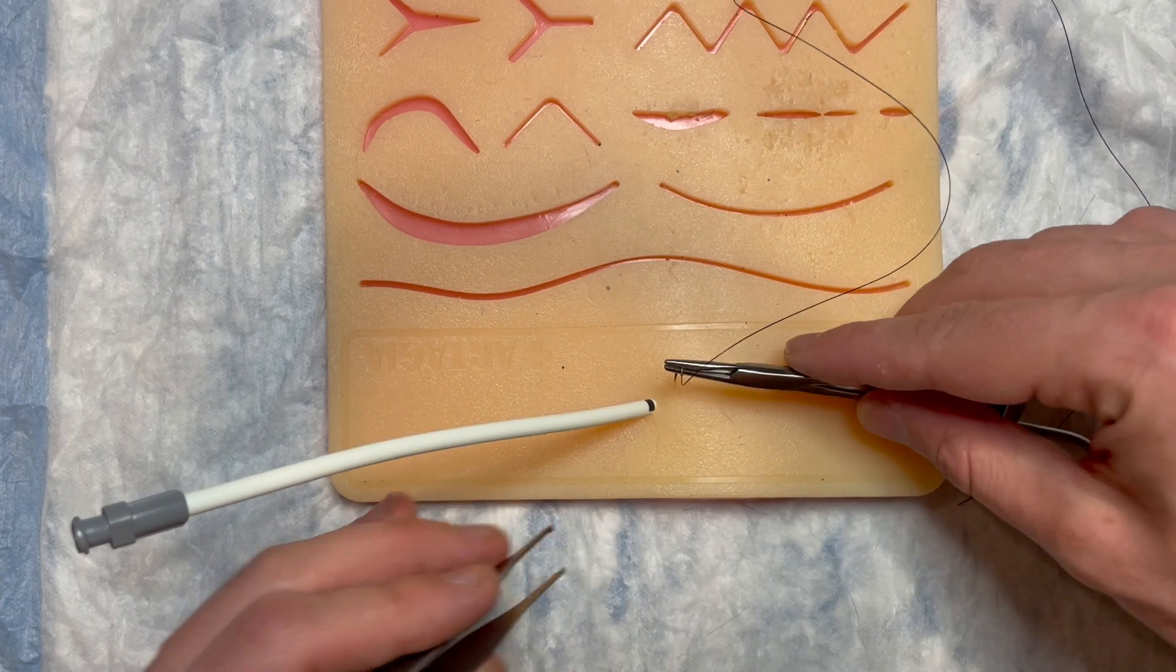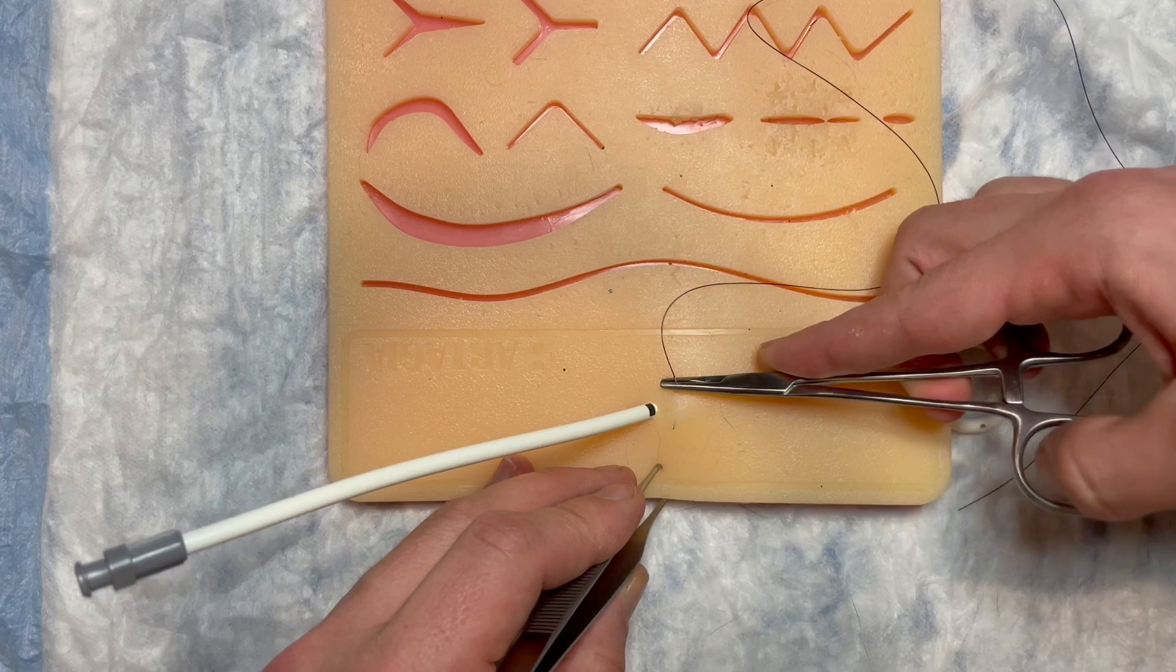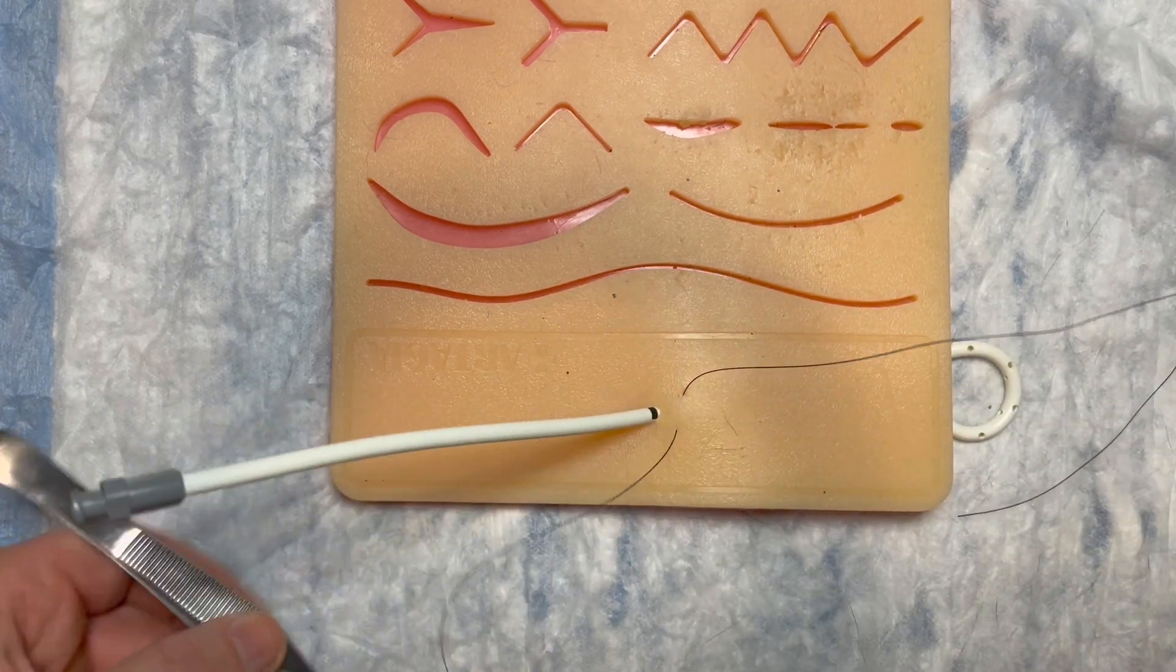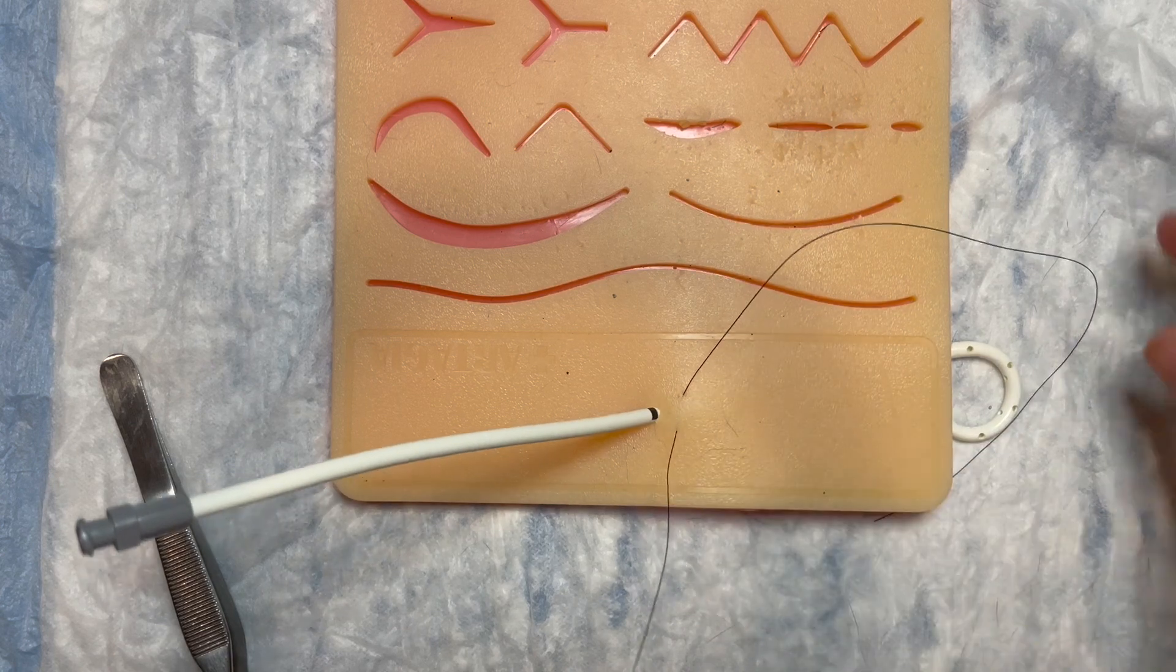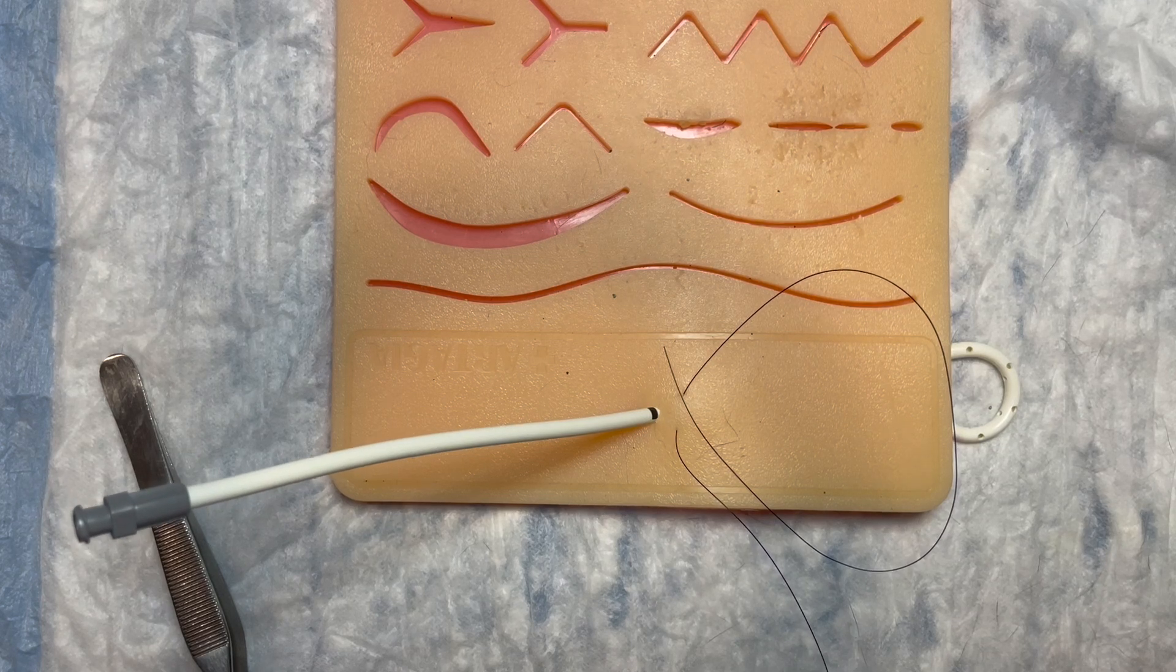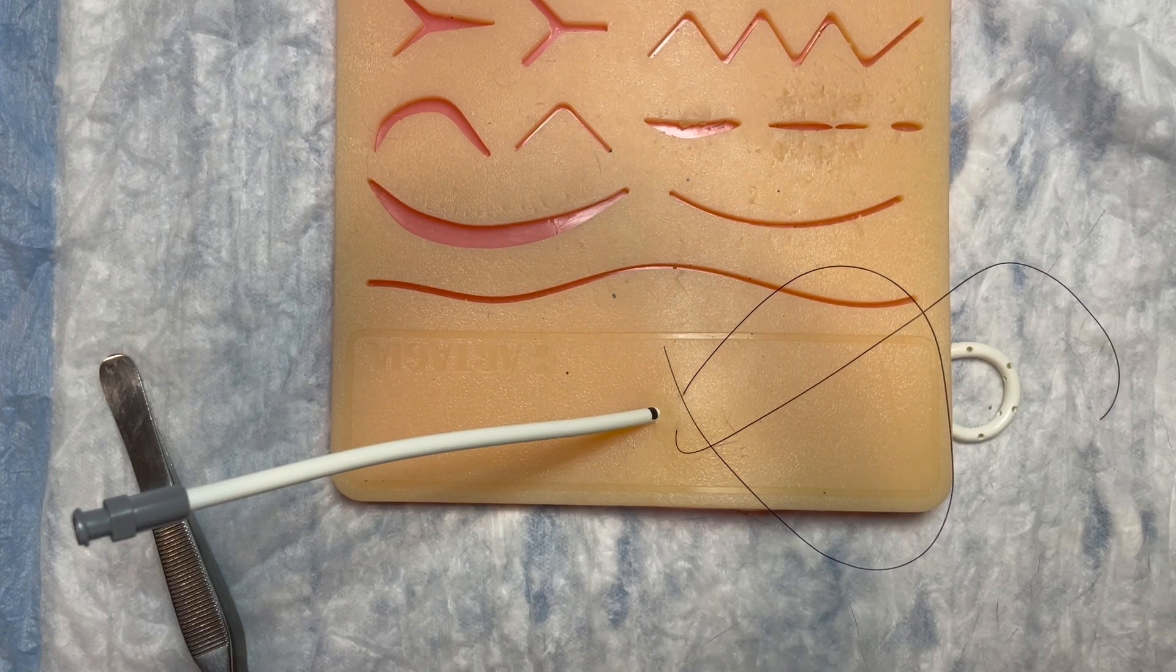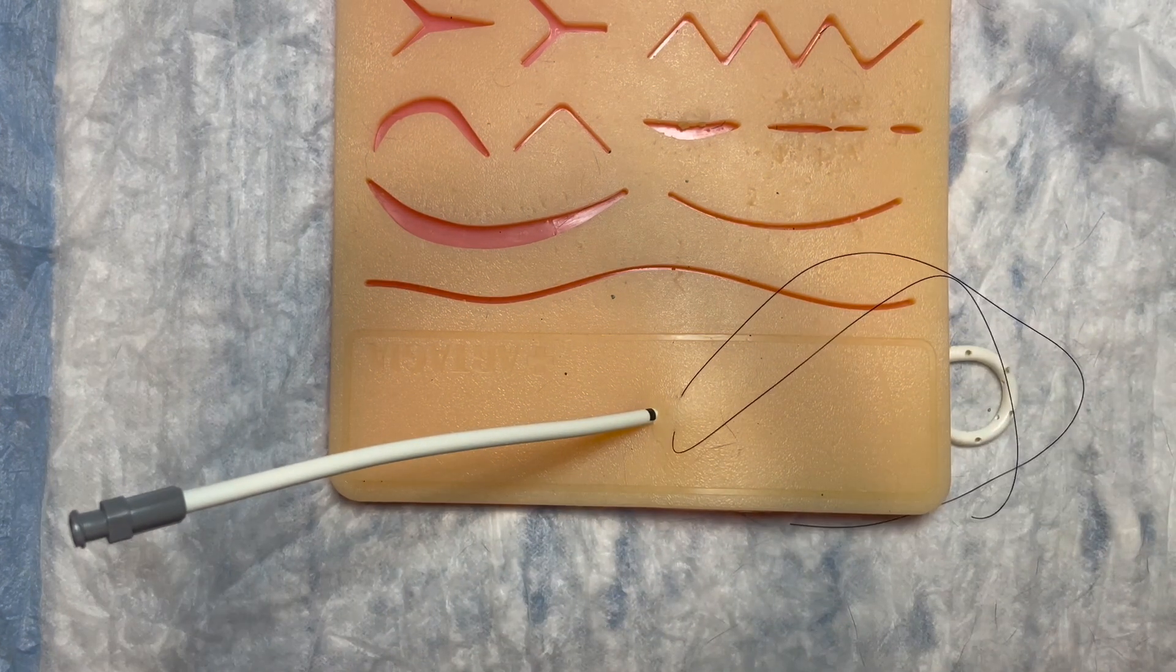So I've got my needle driver here and I'm going to create a really big bite because I want this to be a secure stitch for this pigtail. So I put a decent bite, I want to get my string about halfway through and we're about there. And now what I'm going to do is just discard this needle, we don't need it anymore. So I got rid of the needle there and now we're just left with two pieces of string.